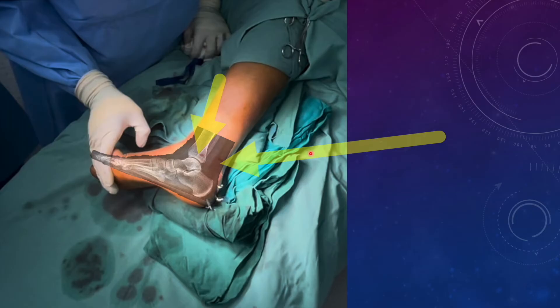So this will be the direction of the axial view and this will be the direction of the lateral view. In the lateral view, you will be able to address the angular parameters and the pitch of the calcaneum. While in the axial view, you will be able to perfectly visualize the posterior facet and any varus or valgus angulation.